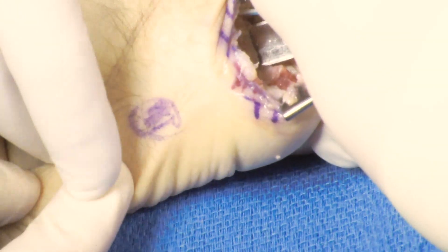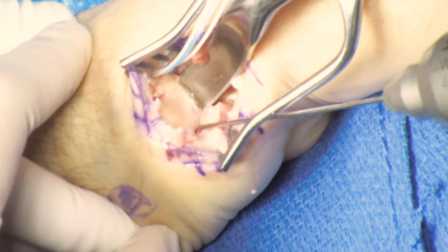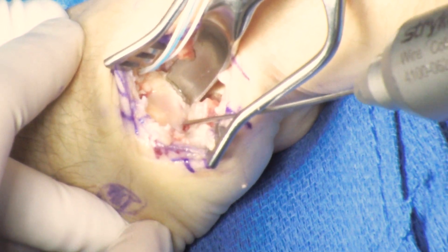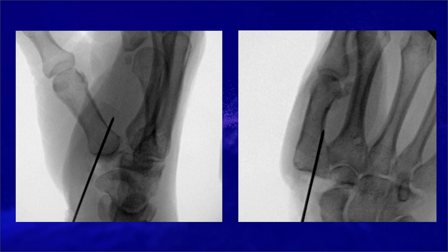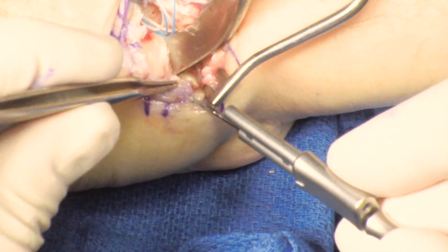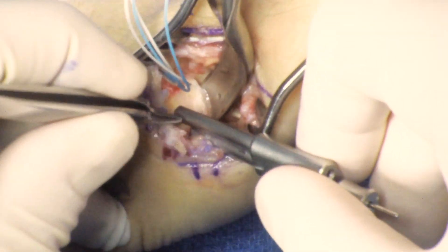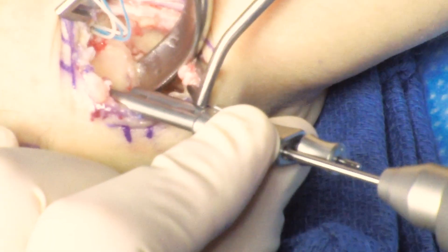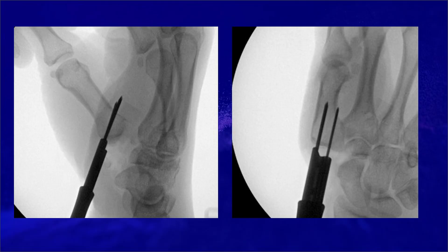The first metacarpal is abducted and flexed. This helps get the insertion point, which is at the junction of the volar and middle third at the base of the first metacarpal, at an angle of approximately 45 degrees. Fluoroscopy shows a good starting point — you want to start as radial as you can get on the base of the first metacarpal and angle 45 degrees to the long axis. Just like on the base of the second metacarpal, the parallel guide is inserted; it can be placed either ulnar or dorsal — I prefer dorsal. The second K wire is inserted bicortically, and a fluoroscopy shot confirms the K wires are parallel and bicortical.